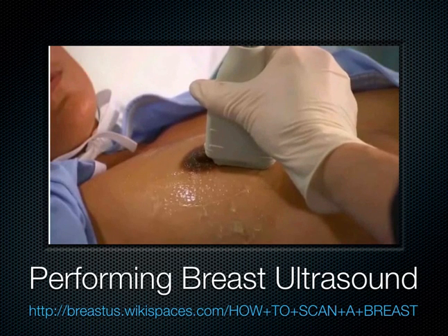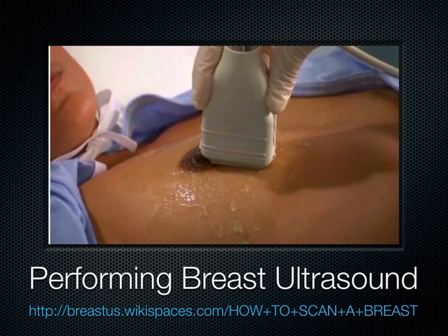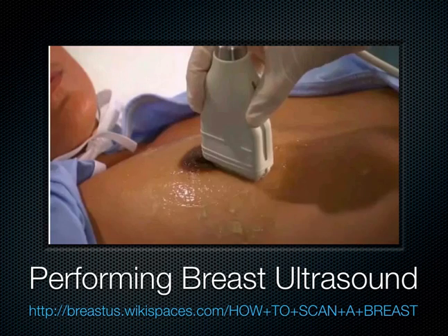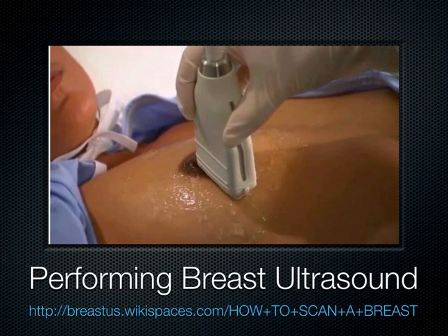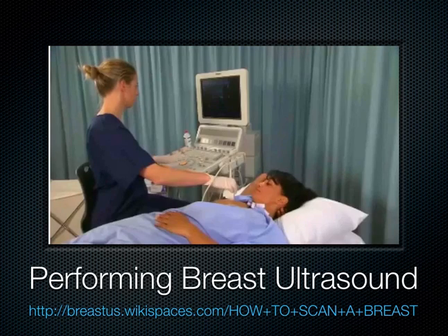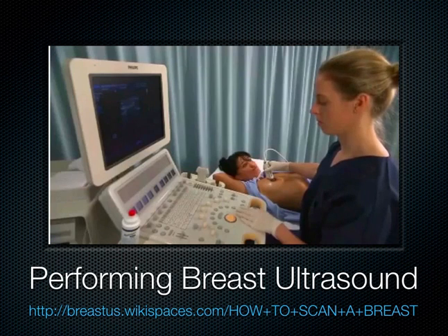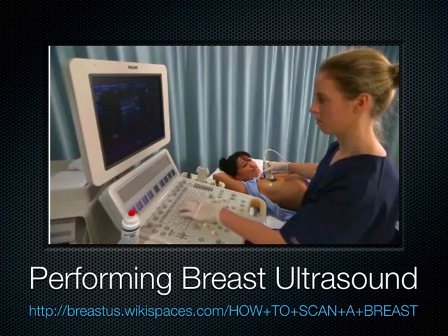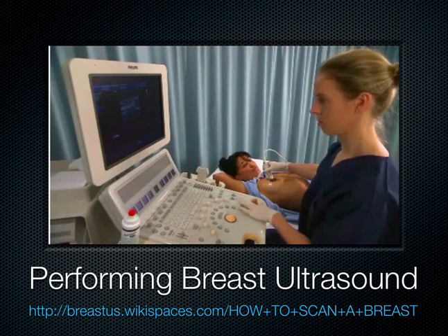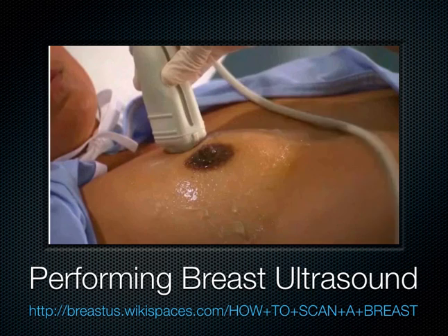After obtaining an image at the 6 o'clock position, reorient the transducer so that the notch faces away from the nipple. Continue to scan in a clockwise direction, saving annotated images at the 7, 9, and 10 o'clock positions. If the entire breast has not been viewed completely during the first radial scan, a second radial scan may be required to image the outer zones of the breast.